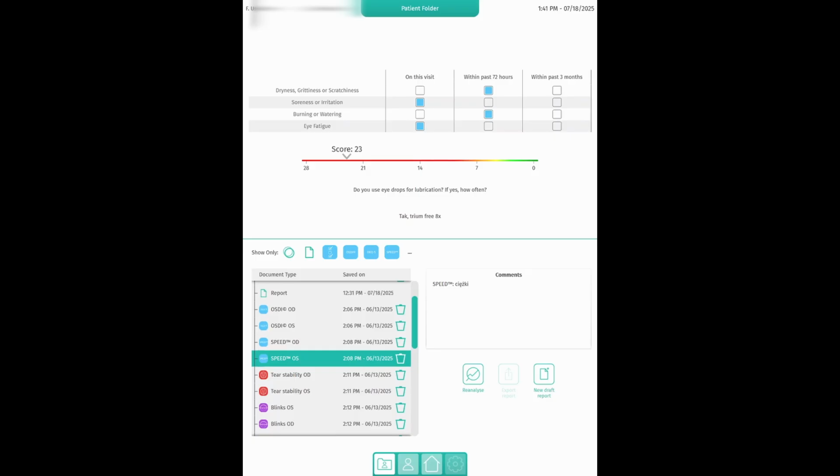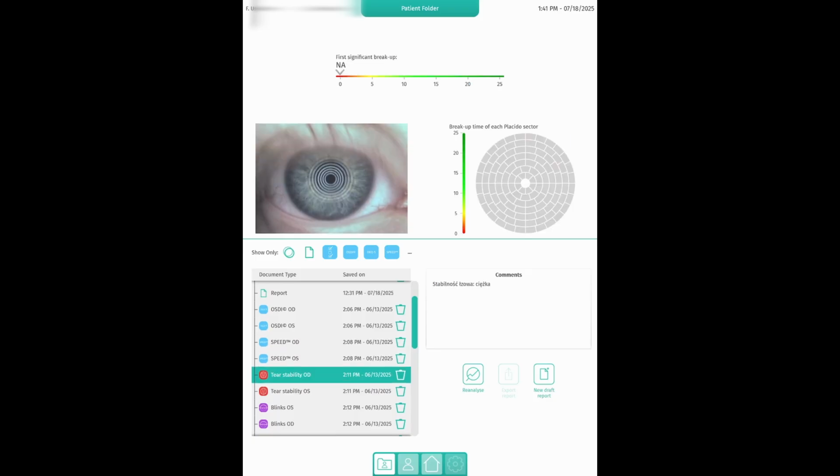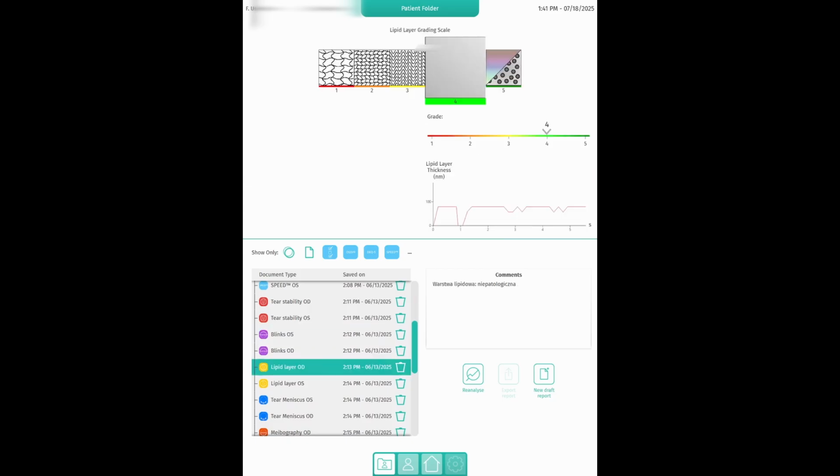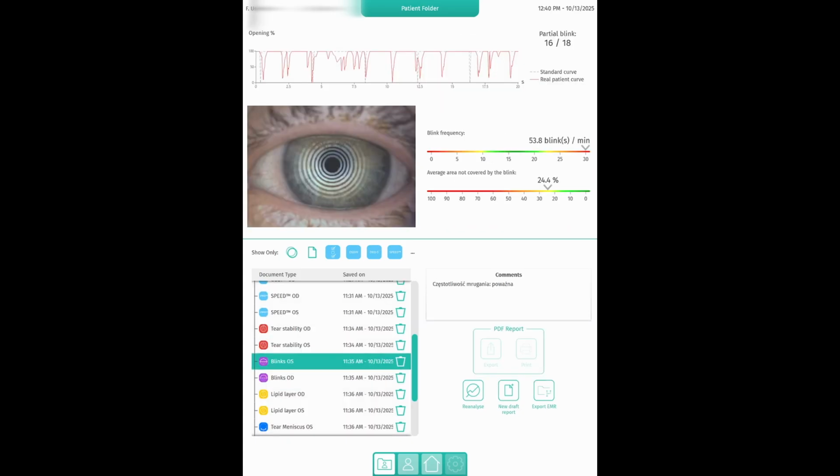So these are the results from the questionnaires. This is how they look. So for both, you have the value and you have the color-coded scale. Plus, you also have comments. But what can we actually measure here?